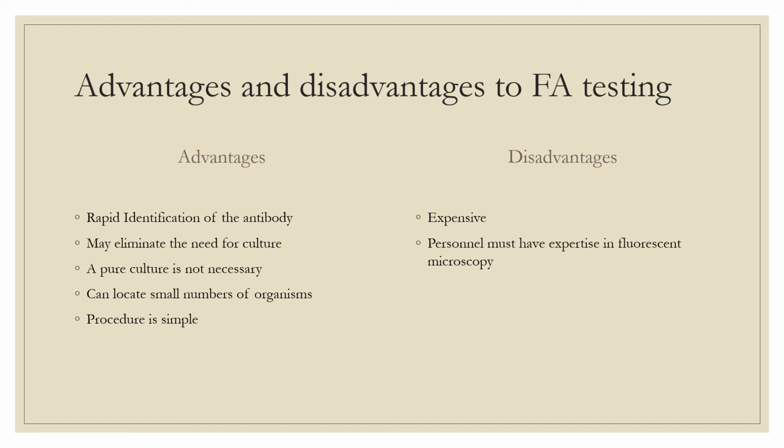A pure culture is not necessary. You can use a mixed culture and you're still going to only get specific fluorescence. And also it's very sensitive, so only a small number of organisms is required to get the sample to fluoresce, and the procedure is quite simple.